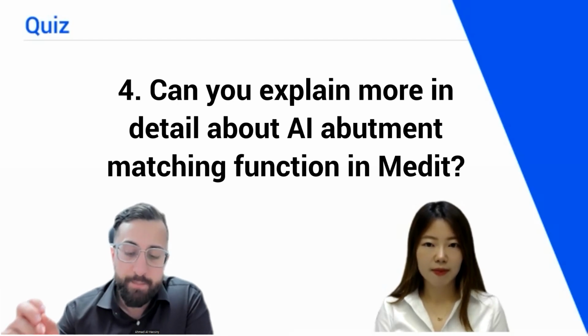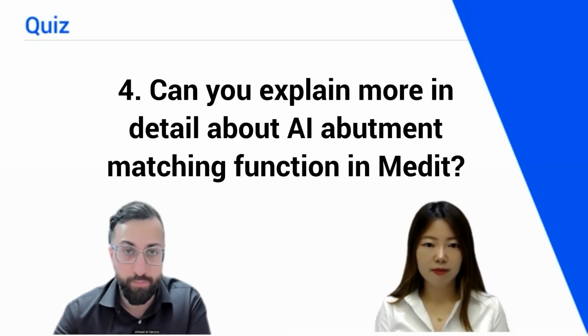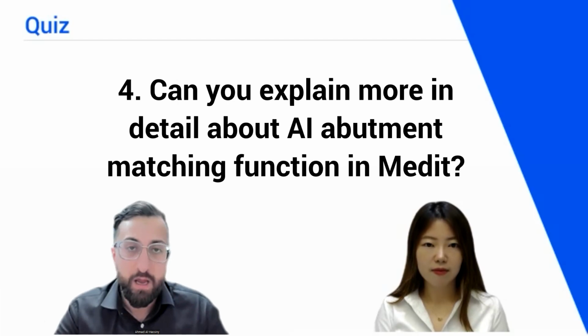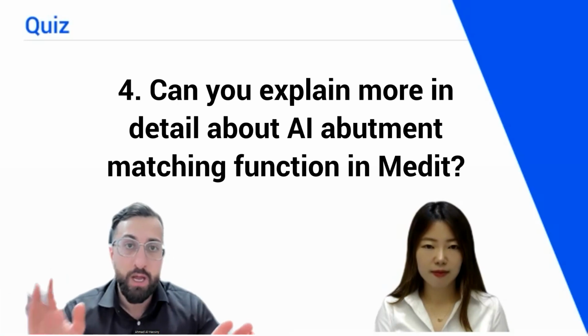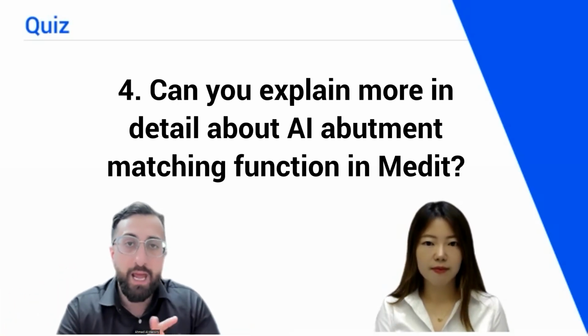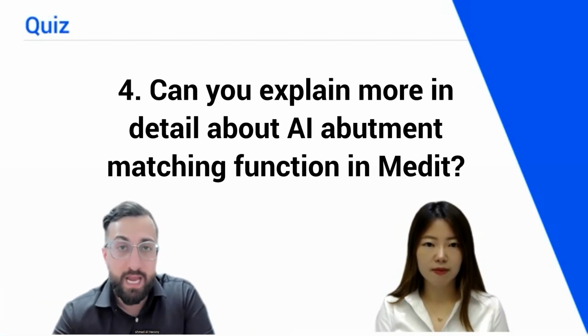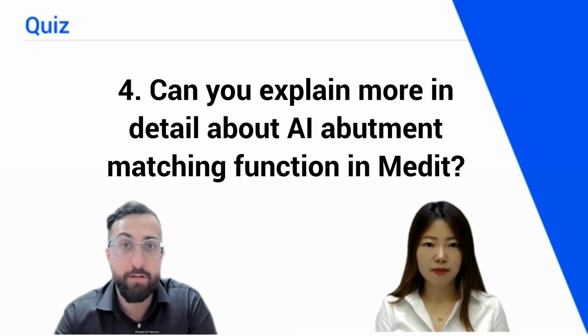So what the Medit software enables you to do is import that library into the software. And where do you get that library? From the implant companies. And when you import that library into the software, when you're scanning, it will automatically tell you if it's been able to join the digital analog to your scan. And what that allows you to do is basically get verification that you've scanned the scan body correctly and there's enough data for your lab. That's how it works. And it's an excellent feature.